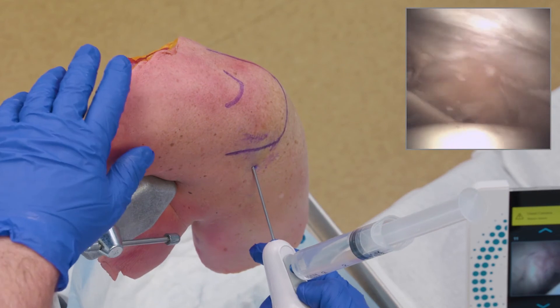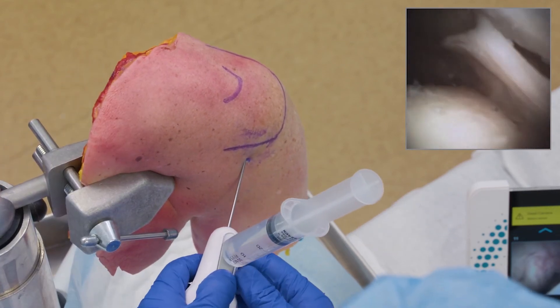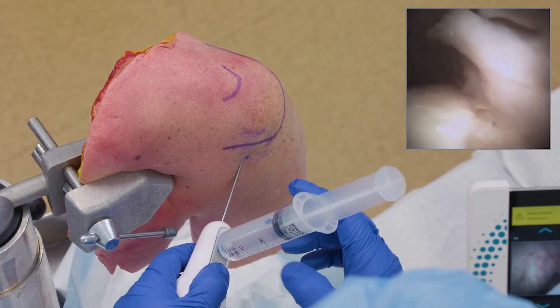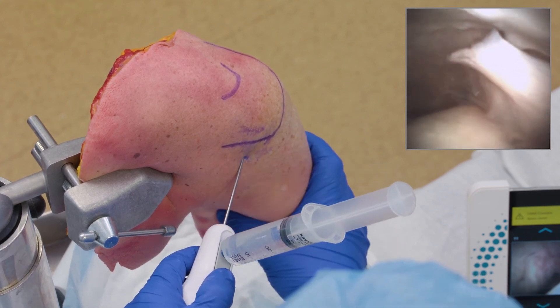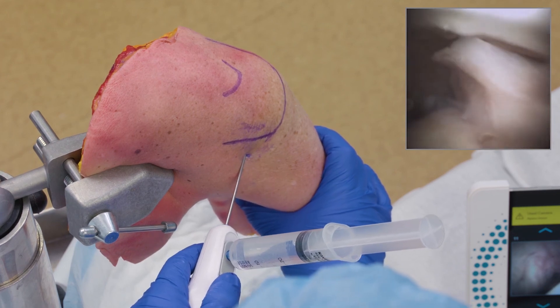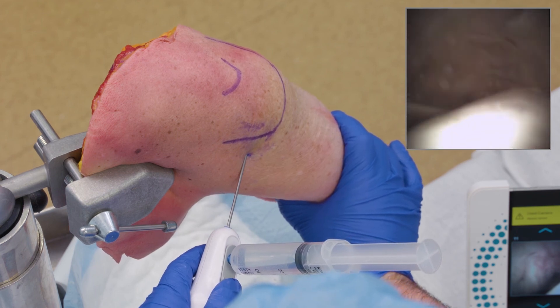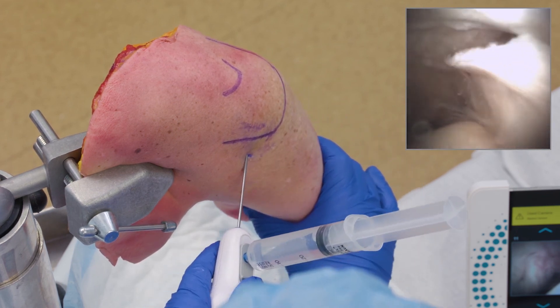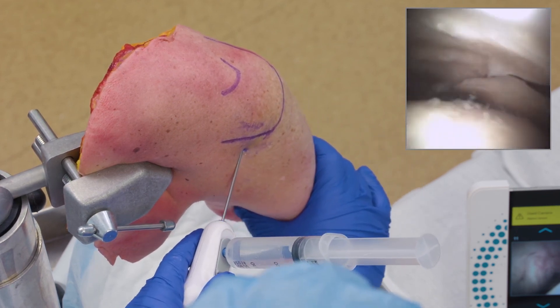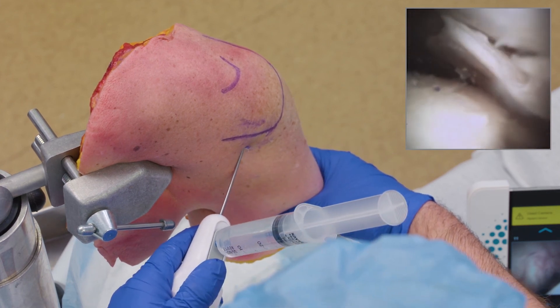When doing our dynamic evaluation of the shoulder, we can also evaluate the rotator cuff for tearing. You can swing over to the top and see a tear here of the supraspinatus where it meets the humeral head. You can abduct the arm while dropping your hand down about 15 degrees to see that rent in the rotator cuff, or drive in a little bit and rotate in the internal and external rotation plane to see that tear a little bit more.